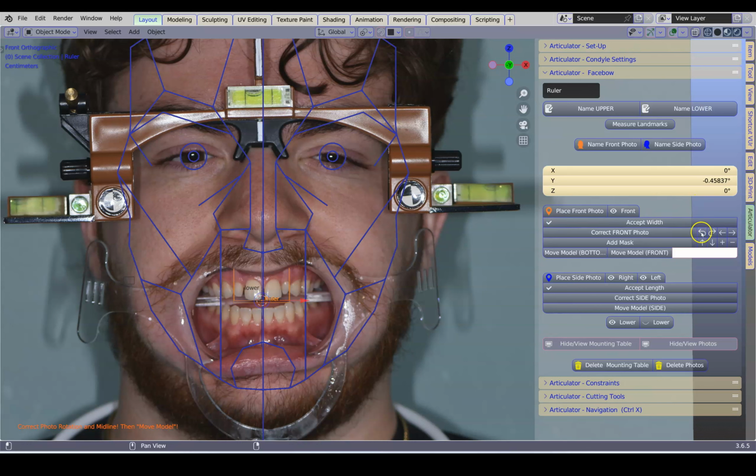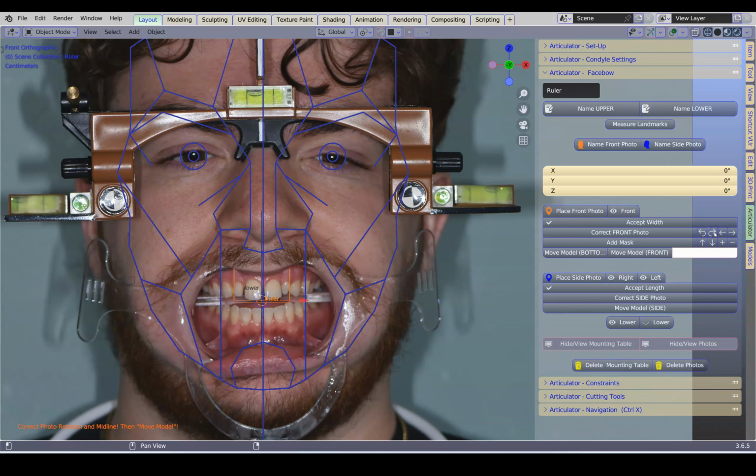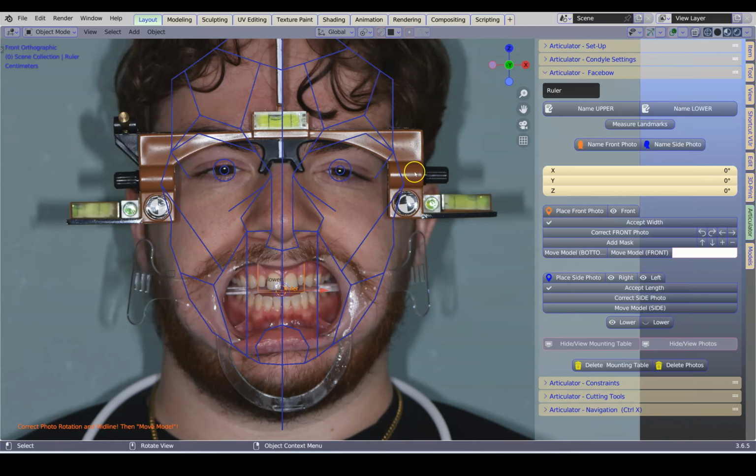Okay, so this is just, I'm just wondering about this, but anyway, it is close enough, so I've put it back. Let's just disregard this, but it's just interesting to see.